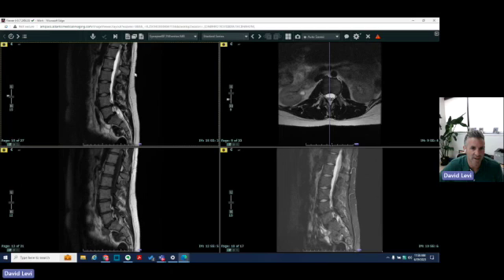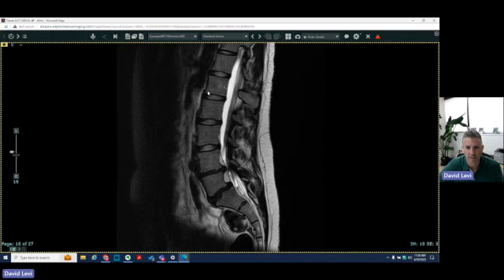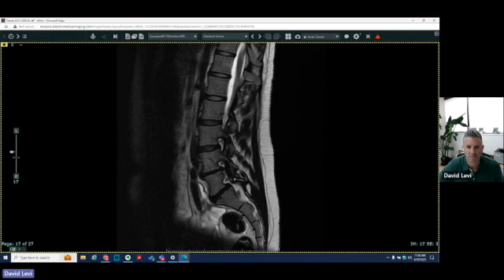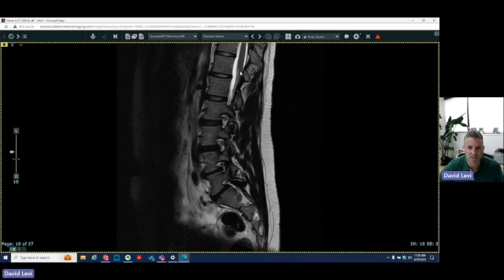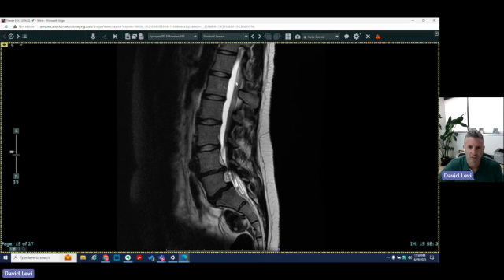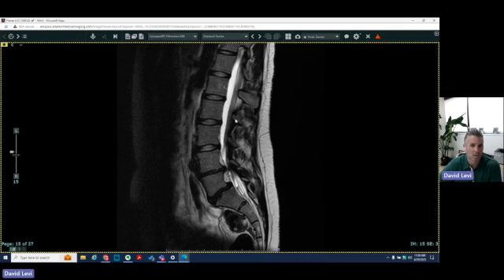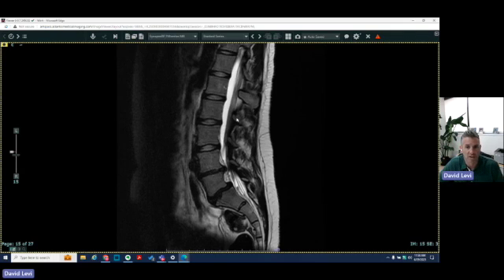We then look at the spinal canal. Here's the spinal canal — this is the cerebrospinal fluid. This is the inferior aspect of the spinal cord known as the conus medullaris. Then we see the spinal roots, which extend further down. We'll then look for actual disc pathology and degenerative changes.